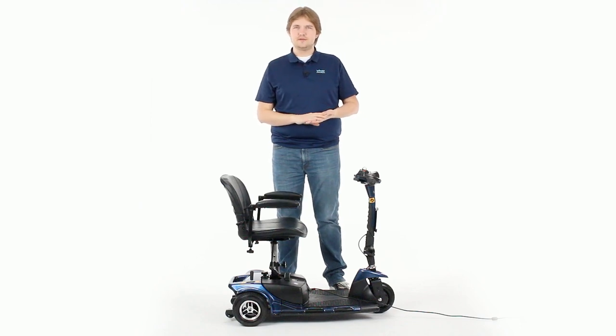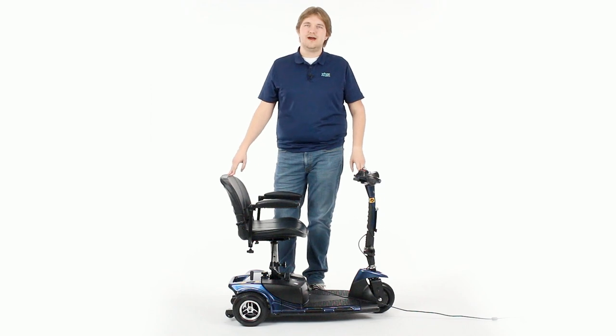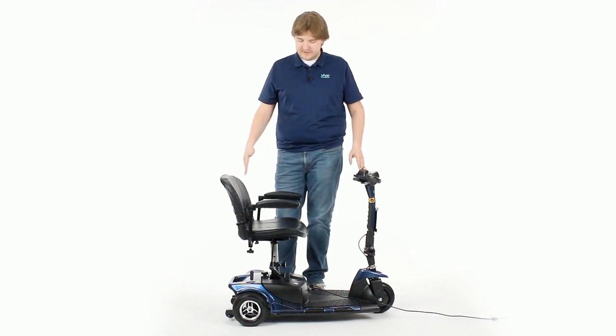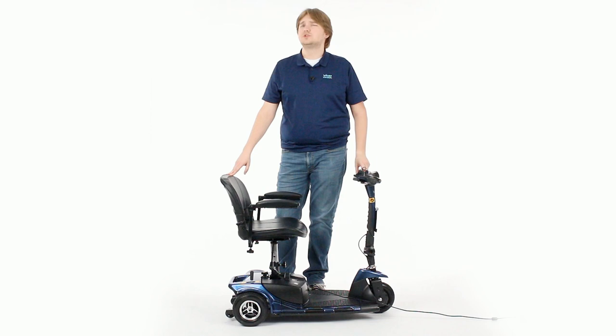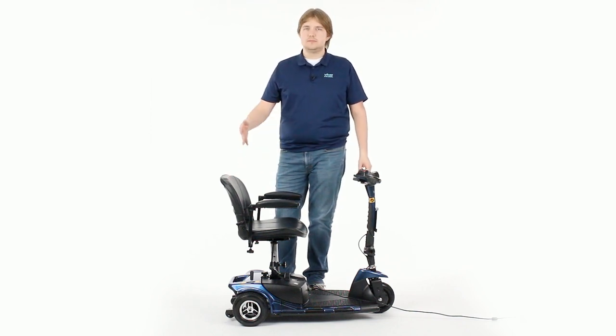Hi, this is Devin from Vive Health Customer Service with a quick video on getting started with your Vive Mobility Scooter. At this point, you've probably got the device fully assembled, the device is plugged in, and the battery is fully charged. This video will just cover three things you'll want to remember when you're getting started to make operation easy so there's no worries.